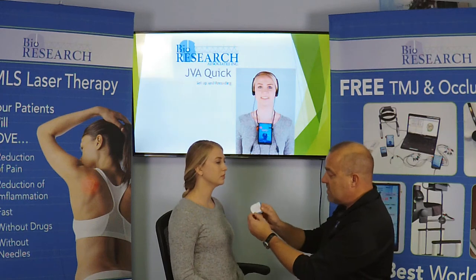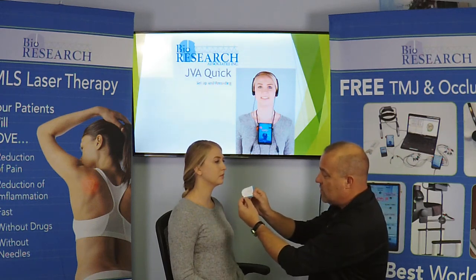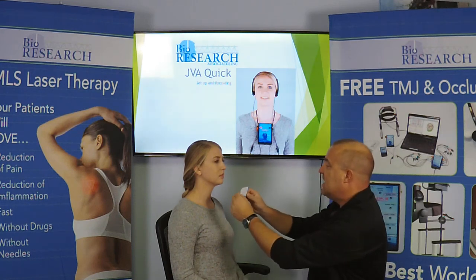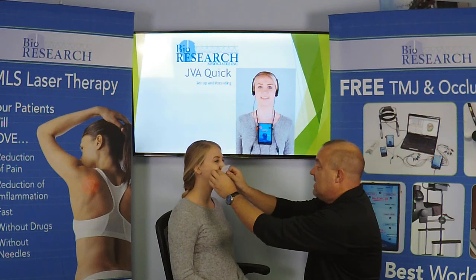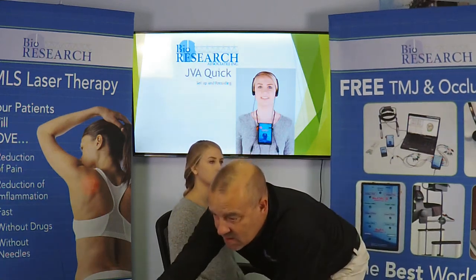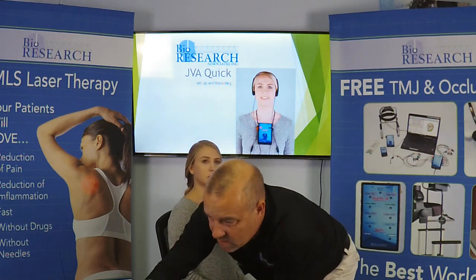For lateral excursions, the best way is to take the range of motion card. This gradation down here on the bottom has an arrow. We just say, let me see your teeth. Bite. Put that arrow right on the center of the incisors. Okay, now slide your jaw all the way to the right. And that is 11 millimeters back to center. And all the way to the left. And that is about 12 millimeters. Very good. So 11 to the right, 12 to the left. We can enter that. So here for the left, we'll put 12. For the right, we'll put 11.